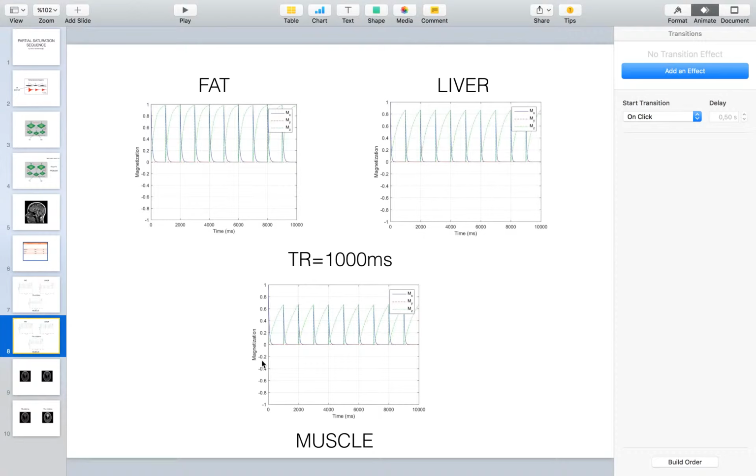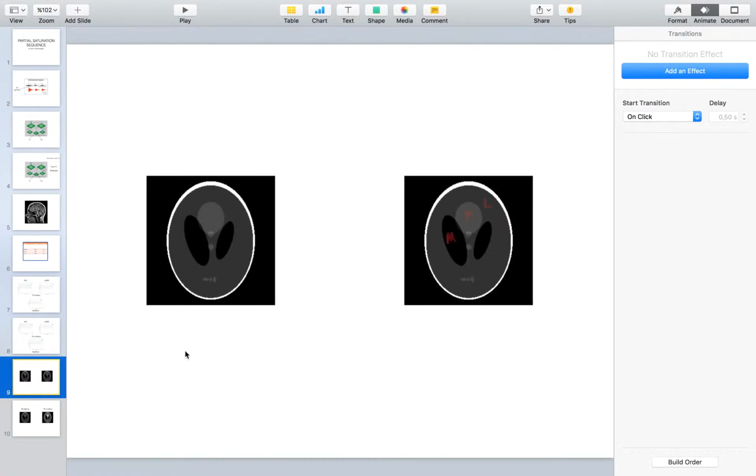So we can see it clearly on the 1D graphs, but what happens if you want to generate a 2D image? For this purpose, I've used the phantom imaging function of MATLAB. These phantom images are used in biomedical research, and this is a sample phantom image. As you can see, there are different regions with different gray intensities. Let me give a new piece of information here.